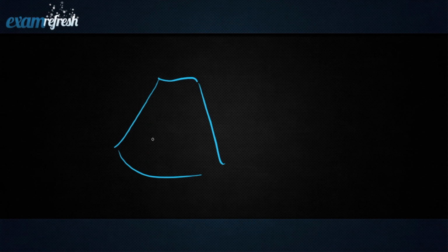Another issue would be, let's say you do have a structure here and you place your focal point here. The pulse still reaches the back because it does have to image the whole thing, but because it's focusing here, that's going to be one pulse. But if you had another focal zone here, let's say there's structures throughout, you're just trying to get a good clean image, and you put in 3 focal zones, that's going to be 3 separate pulses. So you're going to decrease your frame rate mathematically by 1/3. You will noticeably see it go down. So every added focal zone is going to decrease your frame rate and your temporal resolution.